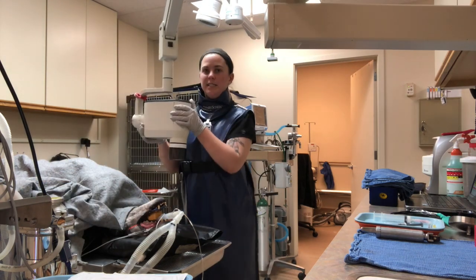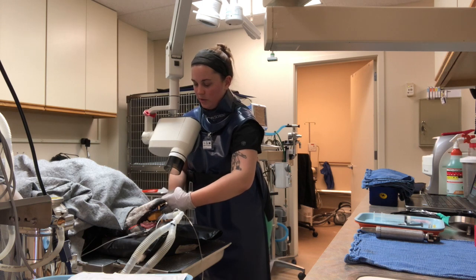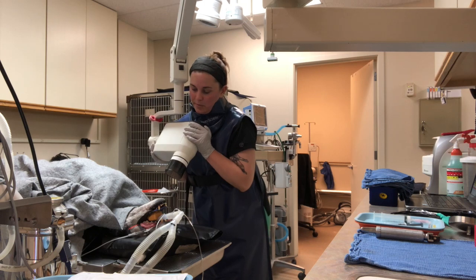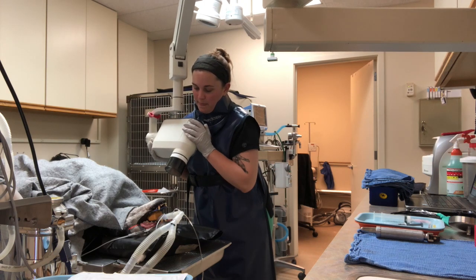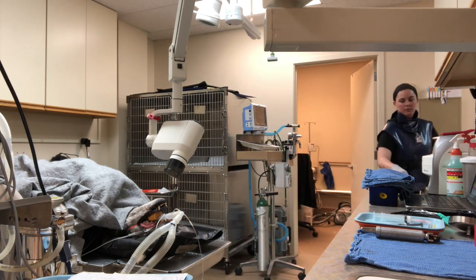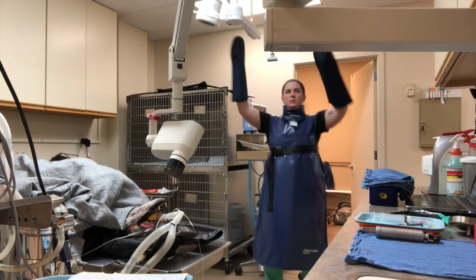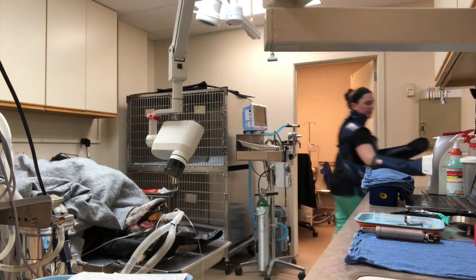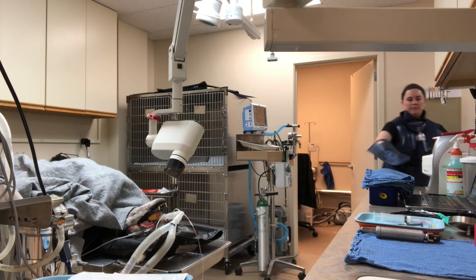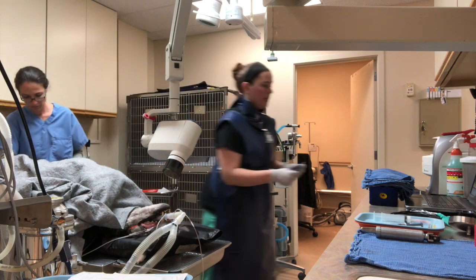I'm going to use a bisecting angle. So the angle of the teeth and the angle of the plate, and then that angle in between is where I want to go. It should be right about here, in that area. I have all my PPE on. Put my gloves on. X-ray. So take this out of his mouth and run this through our ScanX reader.